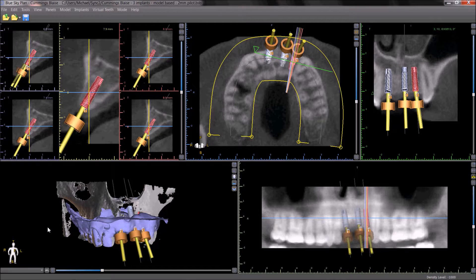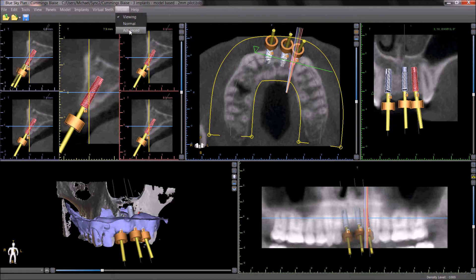Blue Sky Plan now contains different operation modes. The modes can be seen by going to the mode menu, clicking and choosing the relevant mode. The purpose of the different modes is to show Blue Sky Plan users catered interfaces that meet their needs.